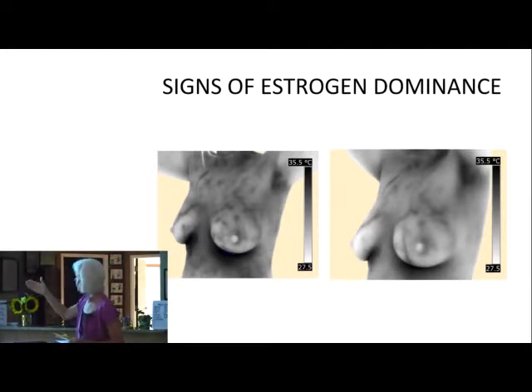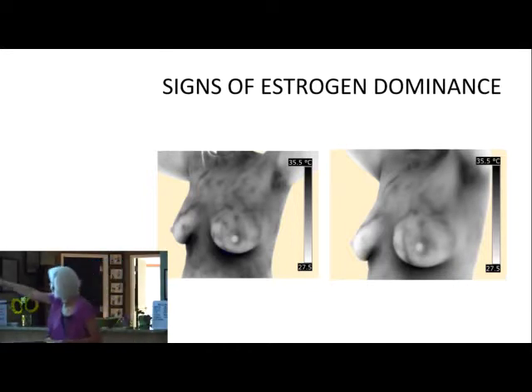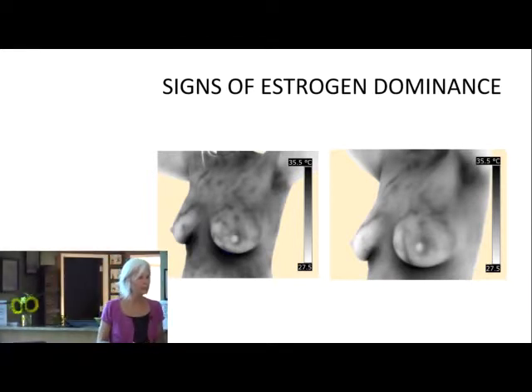This particular practitioner, who is health conscious, worked nonstop all day long without a break, which is stressful. Estrogen dominance is created when not necessarily your estrogen levels are sky high, but relative to your estrogen level, your progesterone level is lower. So you could be low estrogen, but if your progesterone is even lower, you can be estrogen dominant. We don't want estrogen dominance. That is a hormonal imbalance. When we see images like this with this polka dotted look, that's an indicator that she's got estrogen dominance.